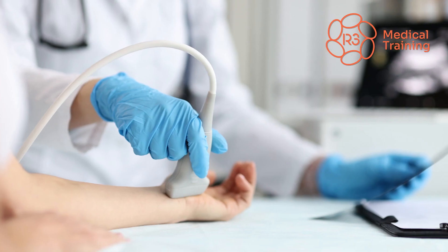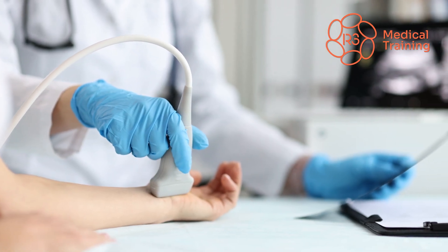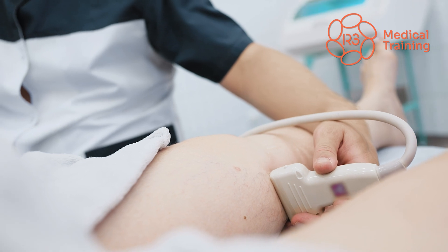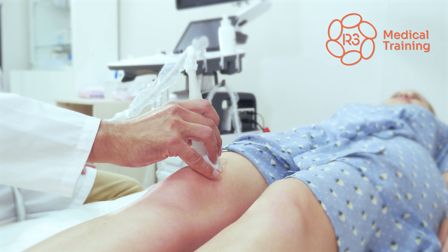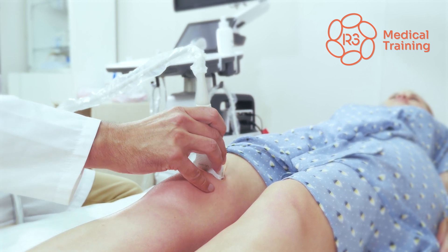Wouldn't you like to wow your patients while they're in your office by diagnosing their joint pain issues in real time with ultrasound scanning? Unfortunately, becoming competent in MSK ultrasound has a significant learning curve.